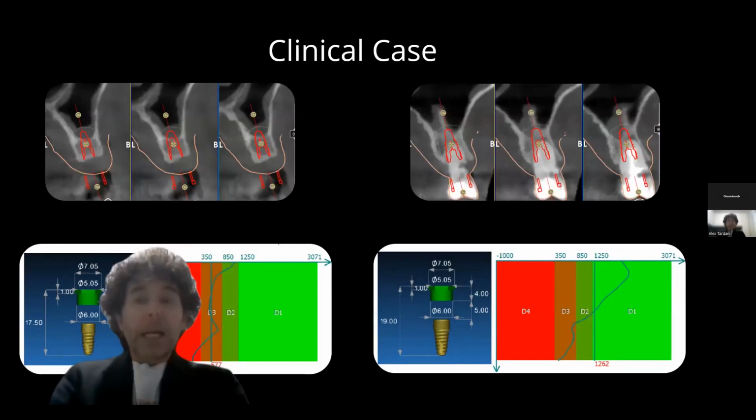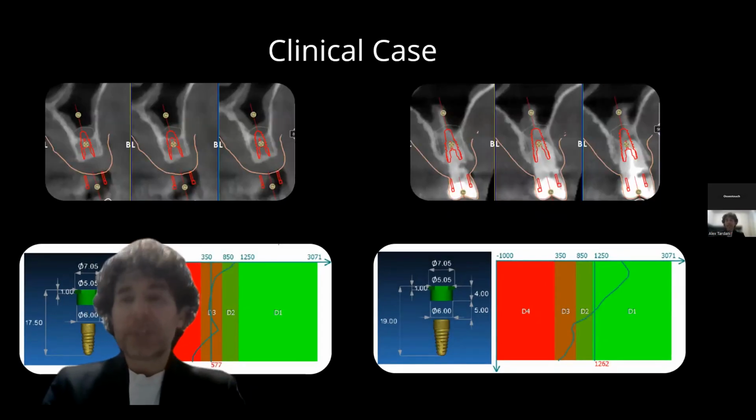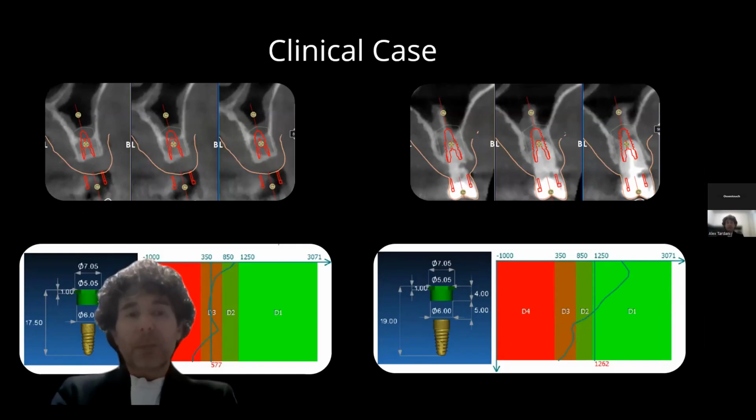On the left side, the situation was slightly more complex. We can see that at site 24, we needed to perform a small crestal sinus lift, but this is a fairly standard procedure when using the mallet. This is the most classic use of the magnetic mallet in the maxilla. In the area of site 25, however, we found a slightly more peculiar situation.